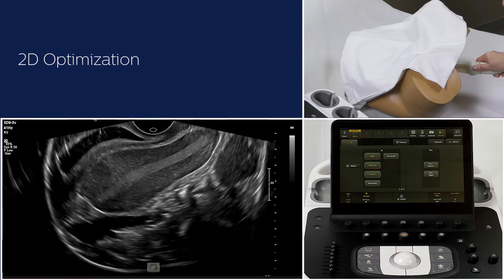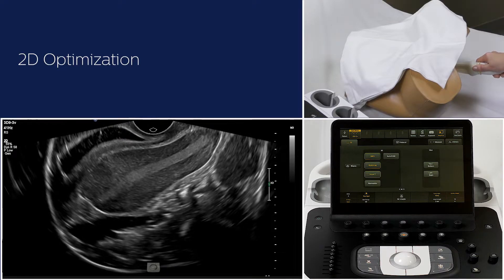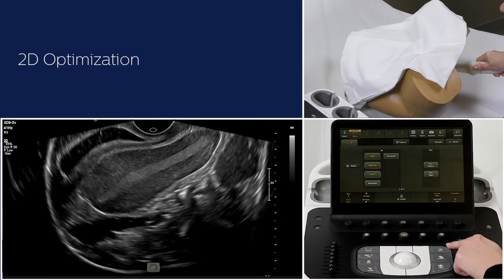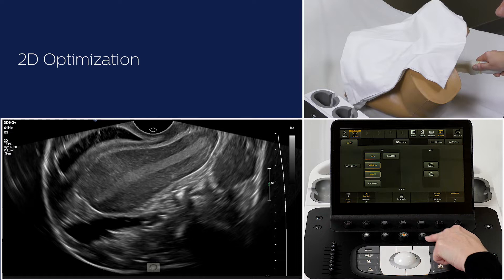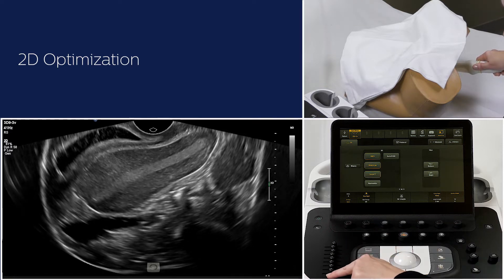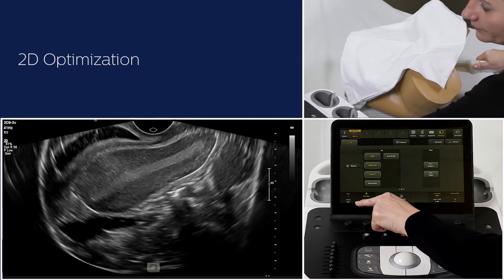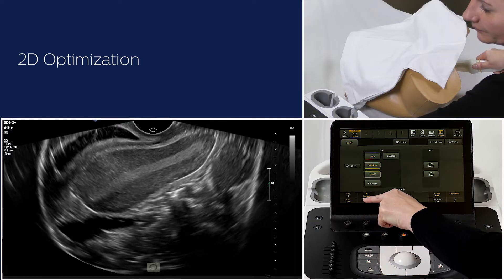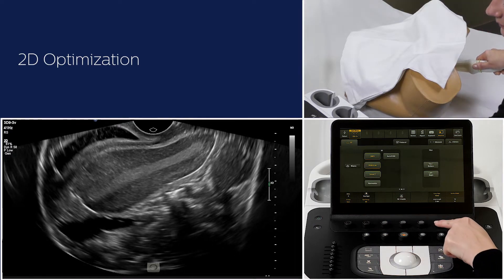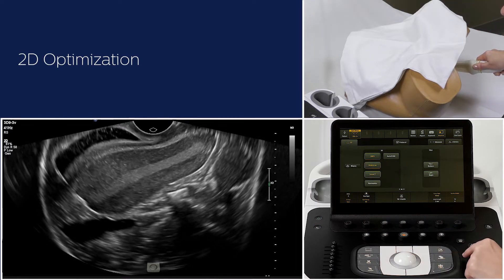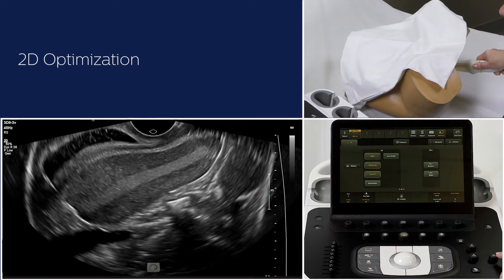First, we need to optimize our 2D image. An optimized 2D image provides a higher resolution 3D data set. We can do this by pressing i-Scan, which optimizes 2D gain and TGC, or adjust settings such as X-RES, 2D Opt, dynamic range, depth and focus.